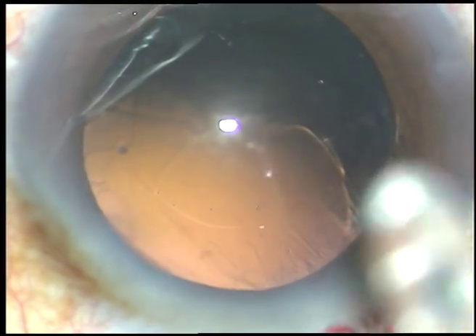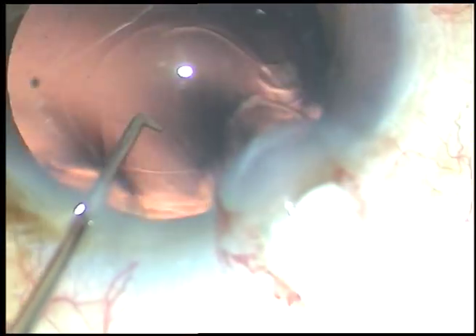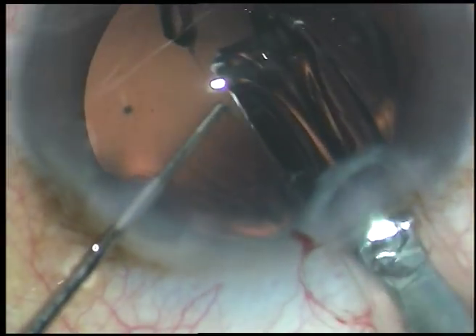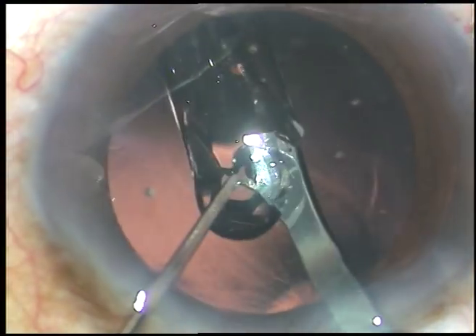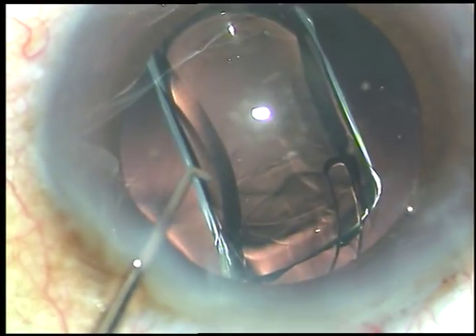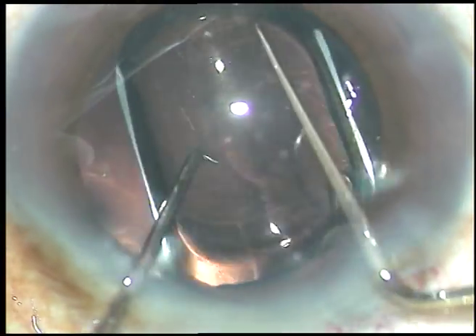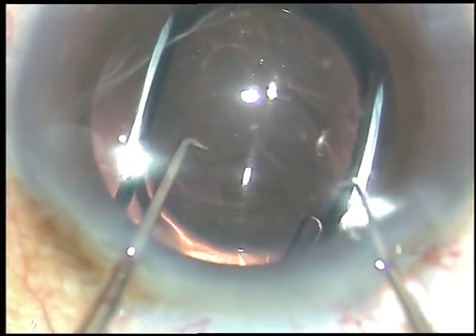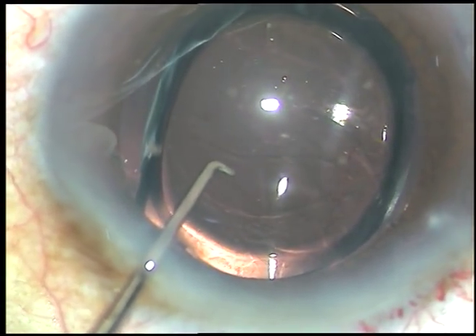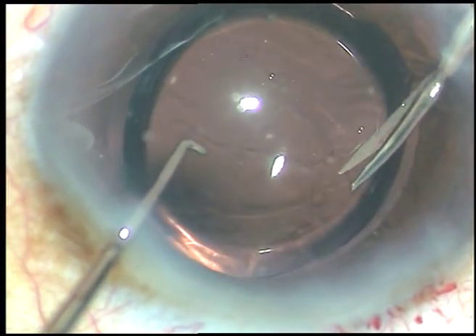In this case, a hydrophobic acrylic intraocular lens is being implanted using viscoelastic substance because I want to enlarge the rexis. The lens has gone into the capsular bag. I dial it, then take the vitreous scissor, go through the 8 o'clock side port, and make a nick at around 10 o'clock.